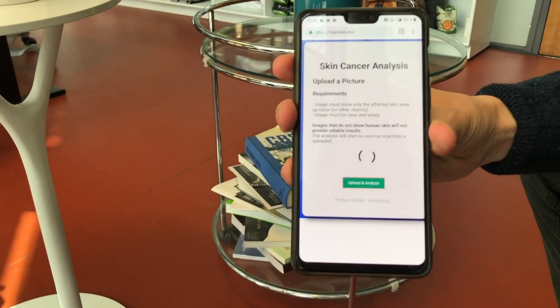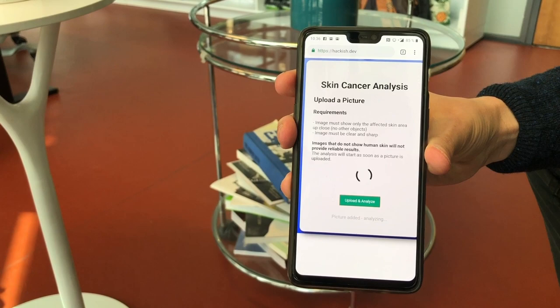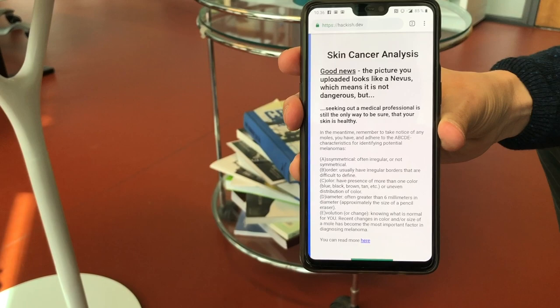As soon as that happens the algorithm runs. We get a response — good news: the picture you uploaded looks like a nevus, which is the most common of all skin lesions, so you have nothing to worry about.